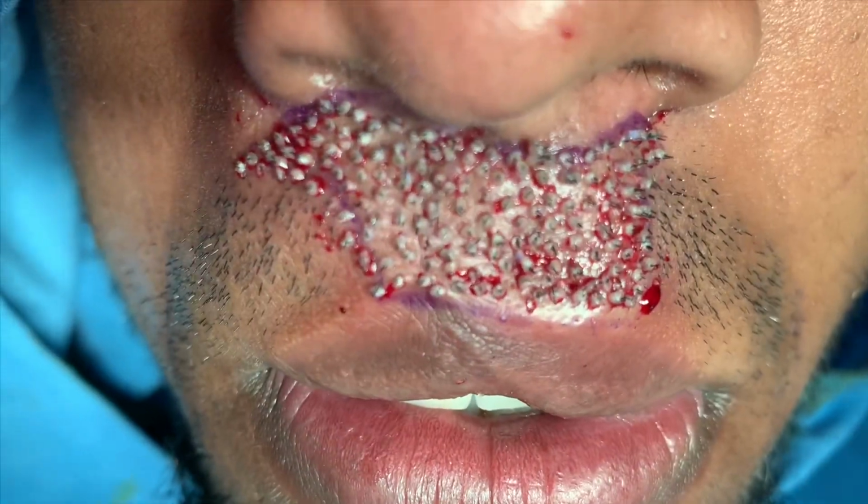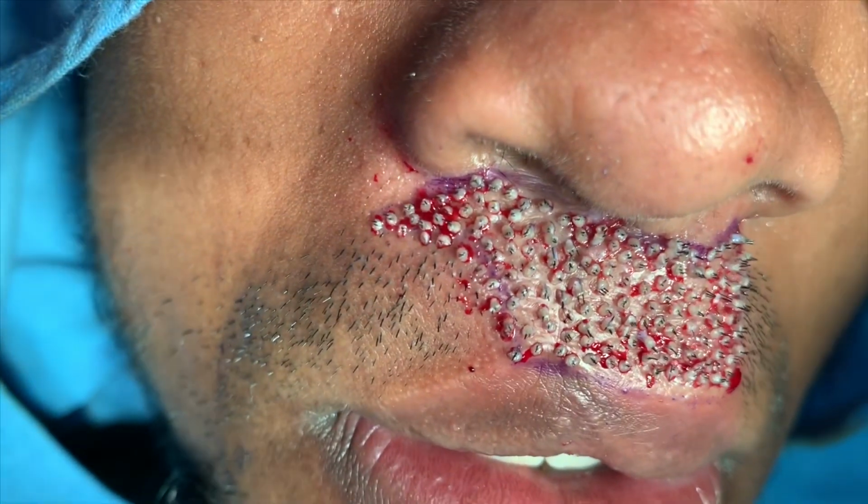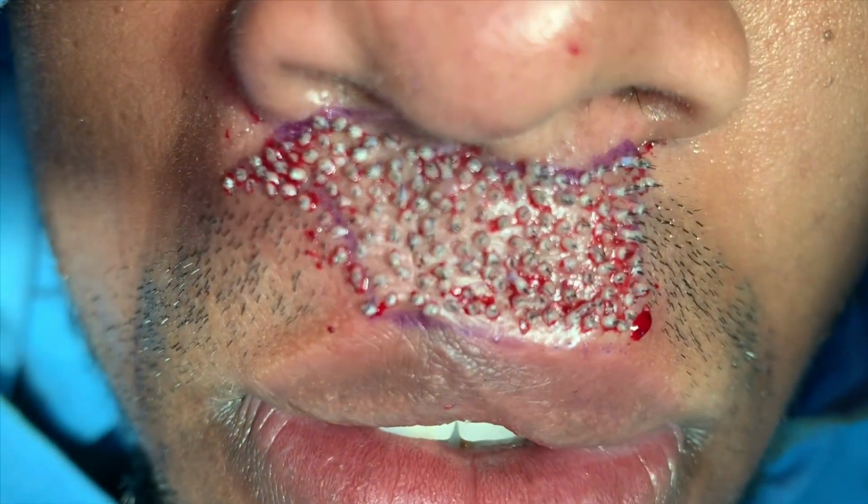So that's done. We've got close to 200 follicles now in this area where he didn't have hair on the mustache region. Also, we've transplanted the scar region.